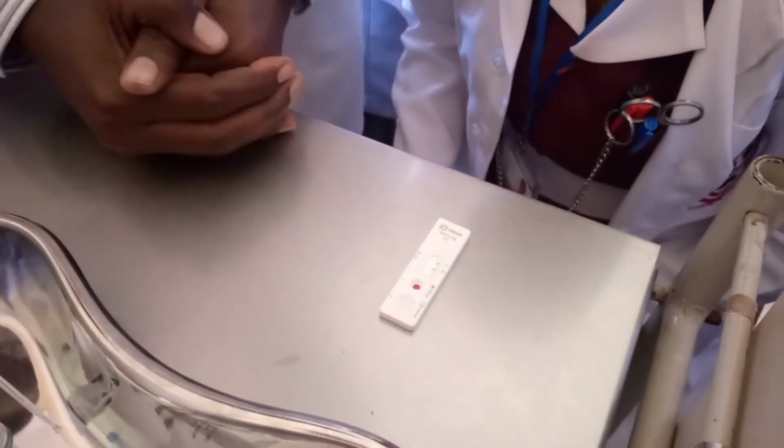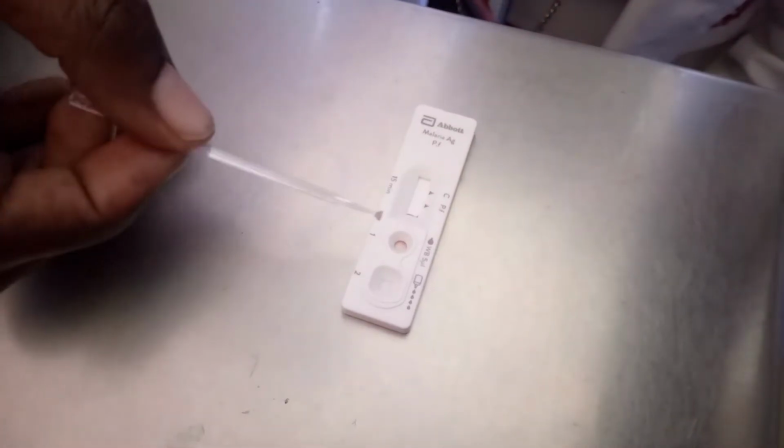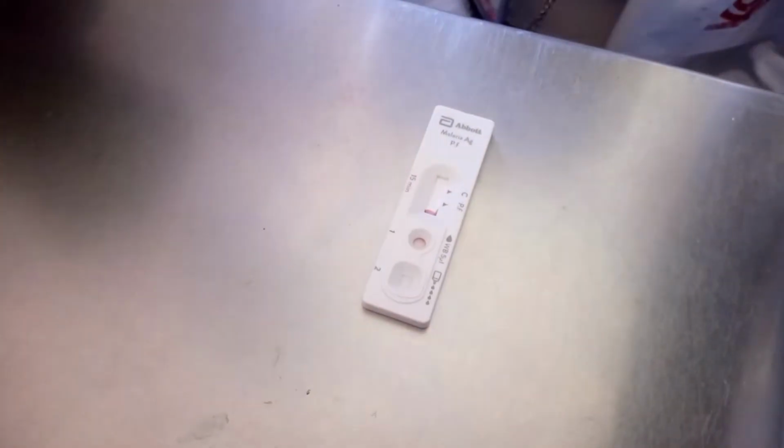You'll be able to observe how it will move. Okay, so at least just be there to watch how the movement will be. So already it's moving, as you can see there. Blood is disappearing there, showing that blood has moved towards the control and where it's written PF. Okay, so you have to wait. So already the diluent and blood have come this way, where it's written PF and C. Okay, so you have to wait a little bit longer.